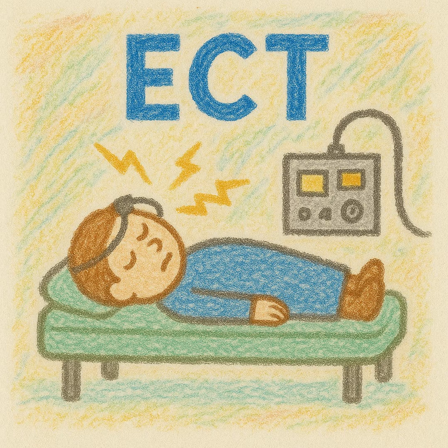So if you get a seizure threshold at 50 millicoulombs after 10 ECTs, the brain kind of adapts. And so the seizure threshold, if you were to recheck, might go up to 75 millicoulombs or something like that. So you might end up seeing some degradation of that seizure quality, and then you might need to start creeping up on the dose later in the course of the series.